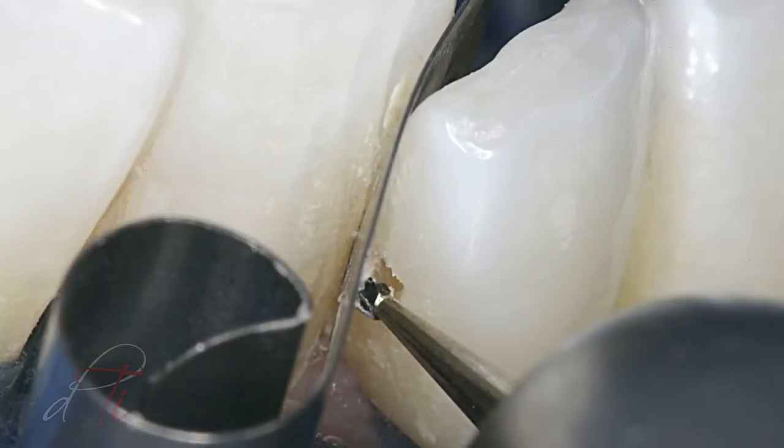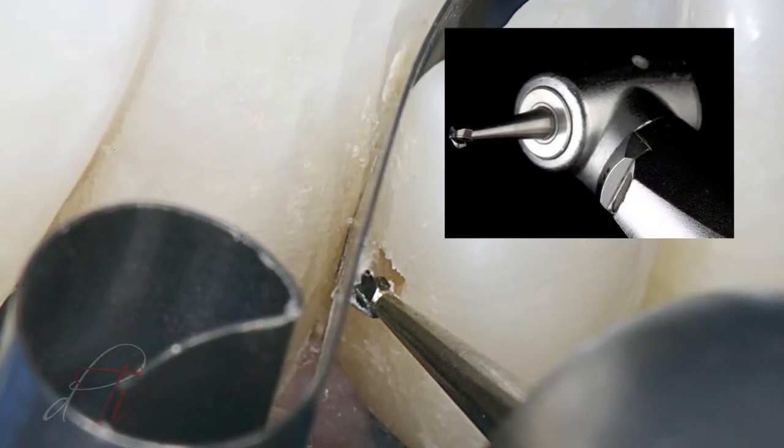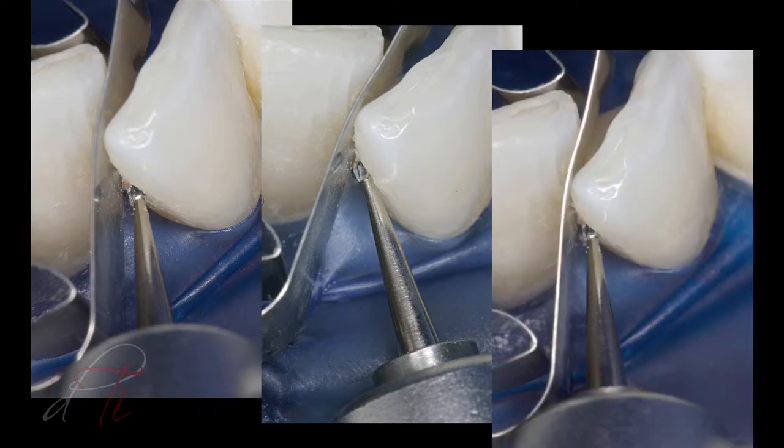Once anesthesia had been administered to the patient, the caries was removed with a number two high-speed round burr, which produces rounded line angles. The outline form was as conservative as possible, without removing healthy tooth structure, unless dictated by caries.